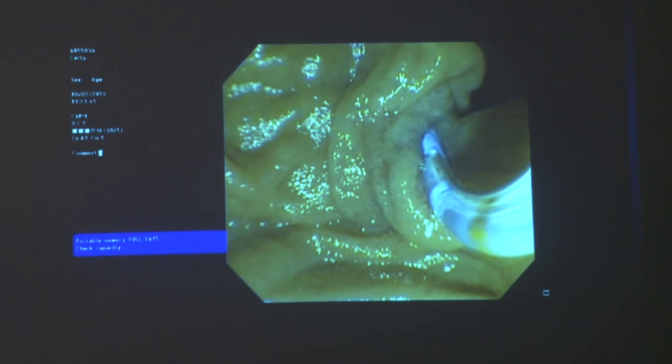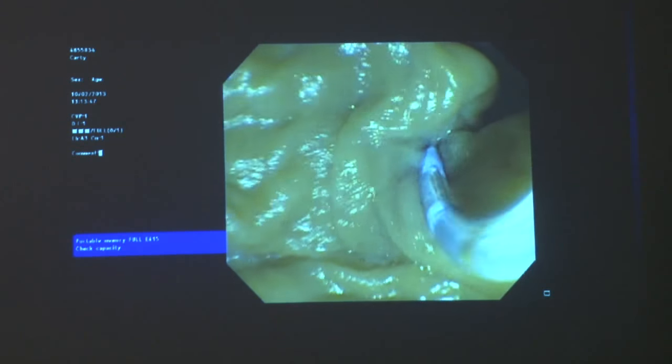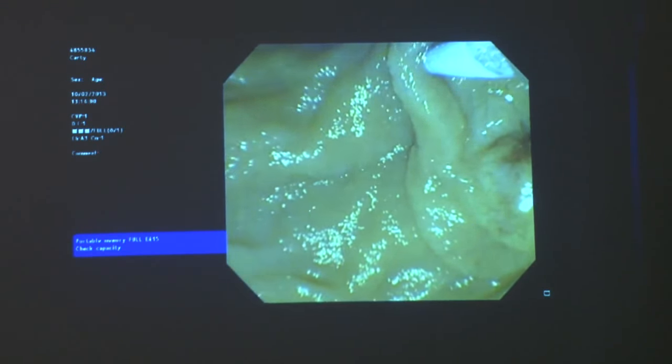Here, before I start this video — even though a diverticulum is there, the papilla is right there and it's a very distorted sphincterotomy right above it. When you start seeing this type of papilla, you start taking deep breaths from the very beginning. So here — I'm not even touching the papilla. I'm trying to get an idea what I have to do and how I can bring this papilla towards me and get it into the right position. I'm still scratching around — and this is the first time I think I got into the right position to touch it. I'm using a wire, but every time I touch with the wire, it just moves away from me.